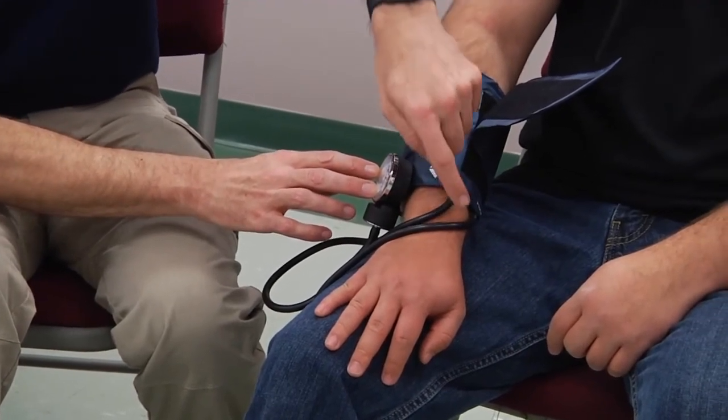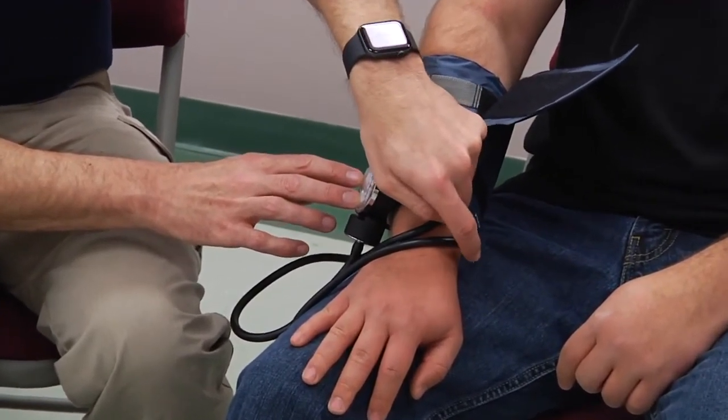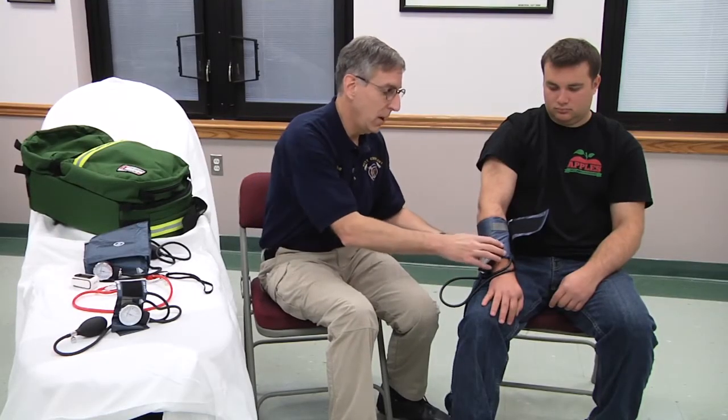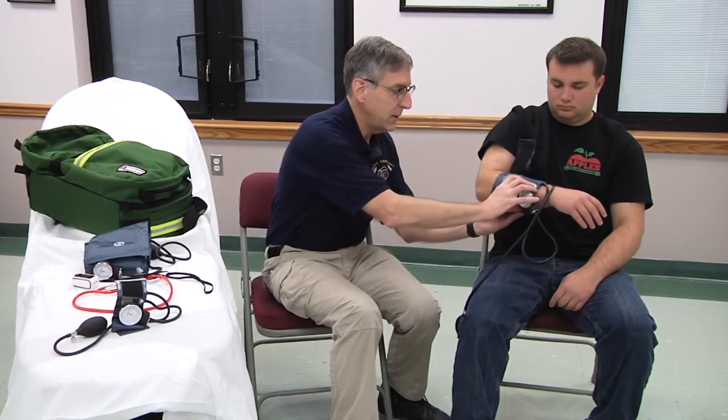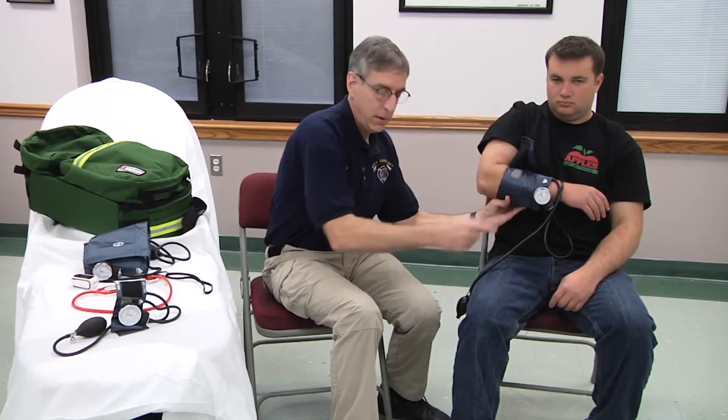You would measure the pressure by palpation, or you could listen with a stethoscope. Going back to what I mentioned earlier — if you're measuring pressure in a lower extremity, that extremity at the time of measurement needs to be at mid-heart level. If doing it in the leg, the patient needs to be flat so that the leg, at the time you're making the measurement, is at the same level as the heart in order to get an accurate blood pressure.